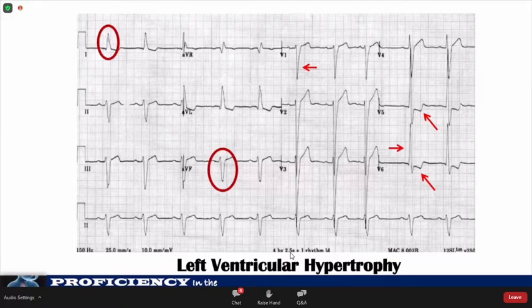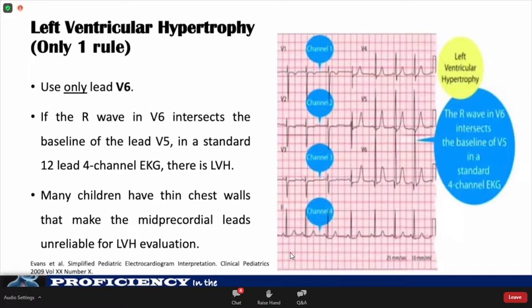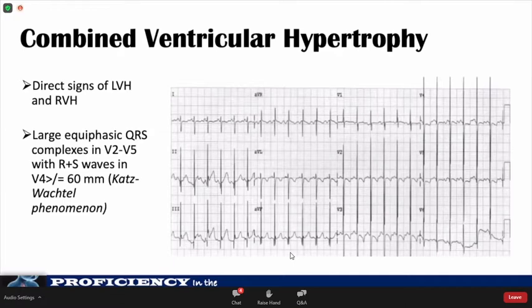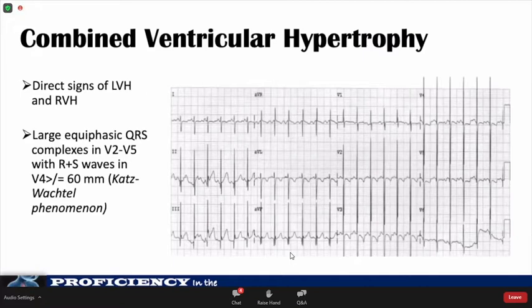Another way of determining LVH is to consider that if the R-wave in V6 and the S-wave in V1 combined exceed the standard threshold, then there is LVH. The diagnosis of combined or biventricular hypertrophy is made most easily when clear criteria are present for both RVH and LVH. It is also considered in the presence of large equiphasic QRS complexes in two or more leads from V2 to V5, wherein the total voltage of the R and S waves is equal to or more than 60 mm — this is called the Katz-Wachtel phenomenon.